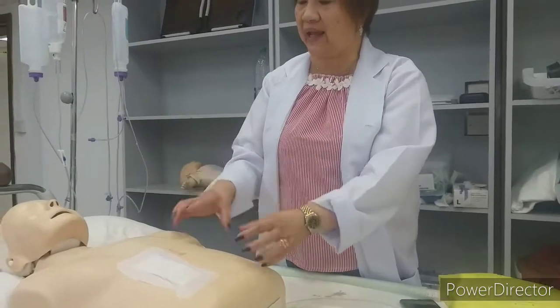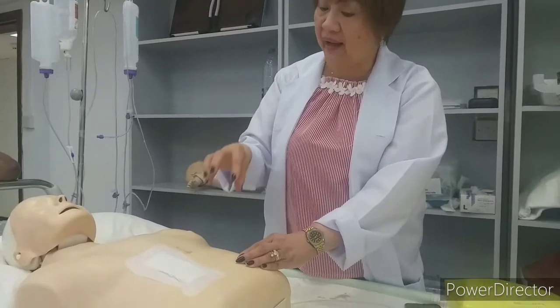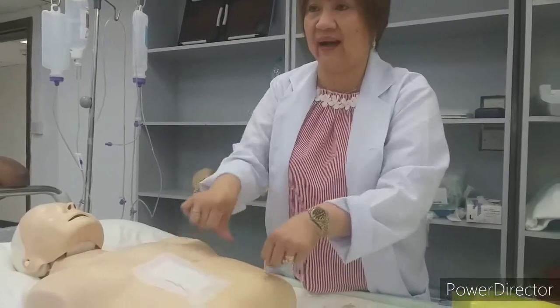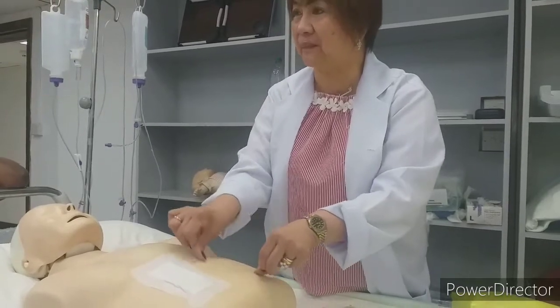Yes. Okay. So there is a bag, a colostomy bag. You have to stick it tight to that, like closing the, what do you call that one? The tie. Okay?